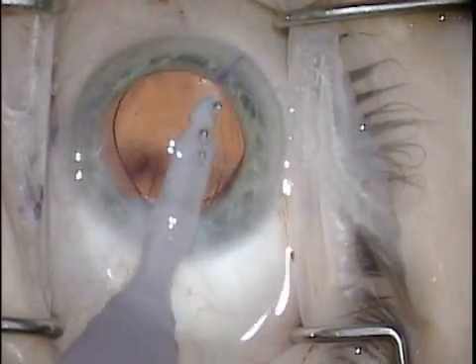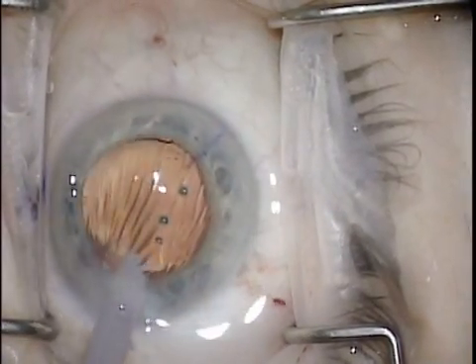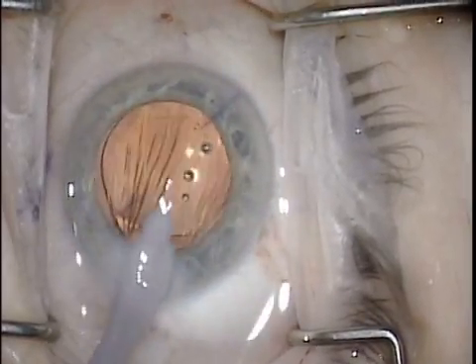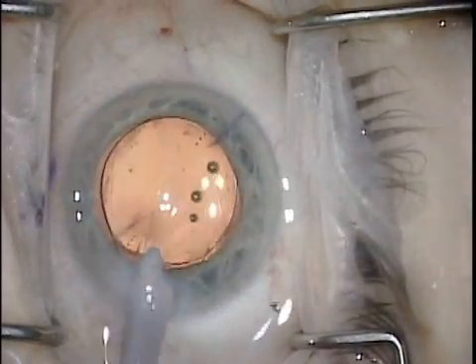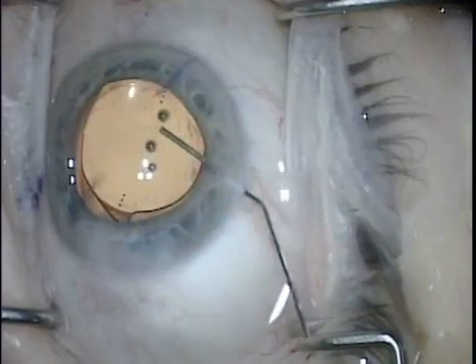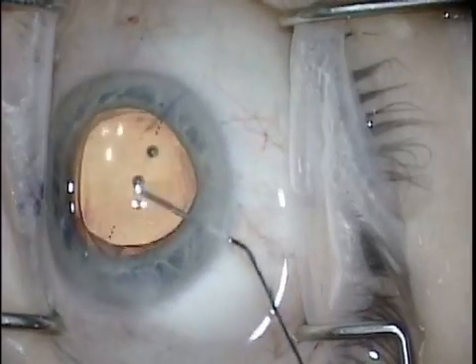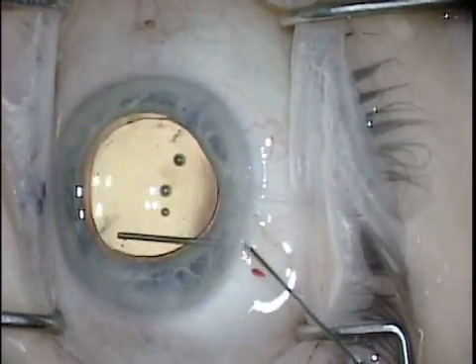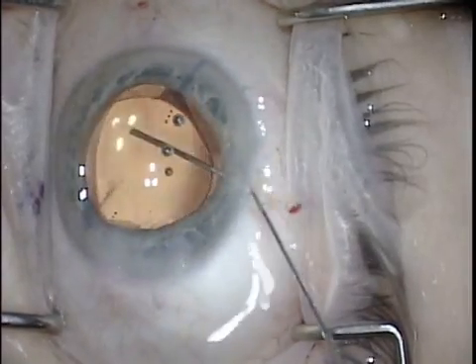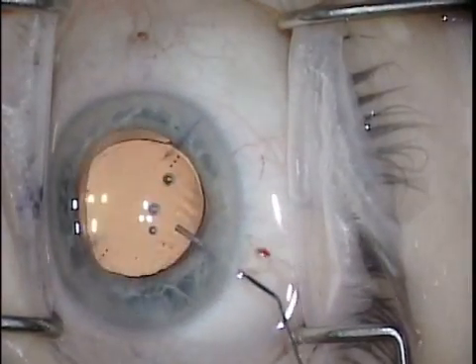The lens is injected into the capsule and rotated 10 or 15 degrees short of the final position. Viscoelastic is removed from behind the lens but may be left in the anterior chamber until the final position is achieved. When the lens is correctly positioned, the index dots on the lens surface will be aligned exactly under the inside edge of the corneal ink marks.